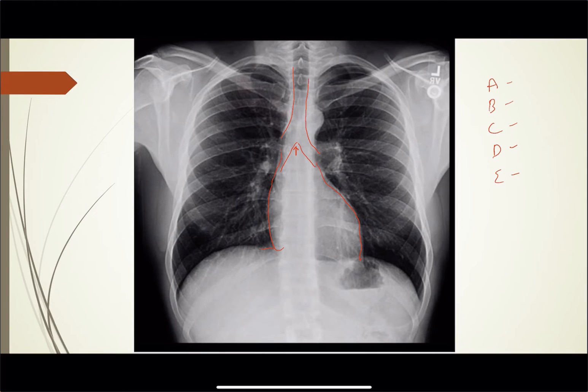D for diaphragm: this diaphragm sits on top of the liver, and this diaphragm over here sits on top of the stomach — this is the gas bubble in the stomach. E for everything else: you can look at the lung fields, you can see the vasculature goes all the way out to the periphery. Basically this is a normal chest x-ray.